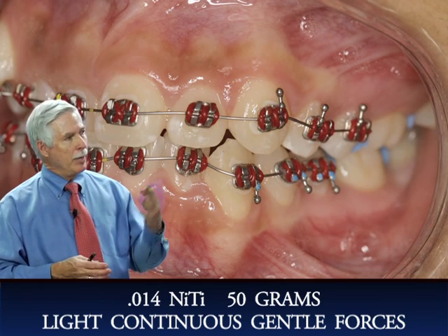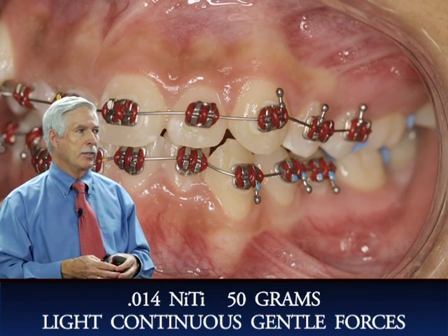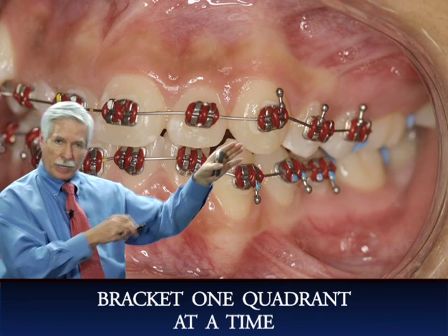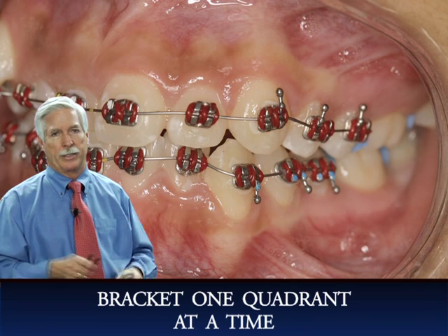If you're a beginner, you might bring the patient in for an hour and spend a little more time and get those brackets on. Do 1 quadrant at a time. Probably start at the central incisor and go back on one side, then the central incisor go back on the other side, and then do lowers and then do the other side. So do 1 quadrant at a time.